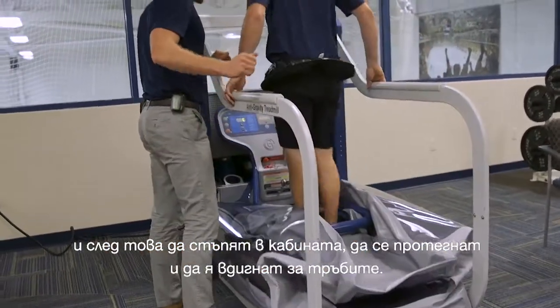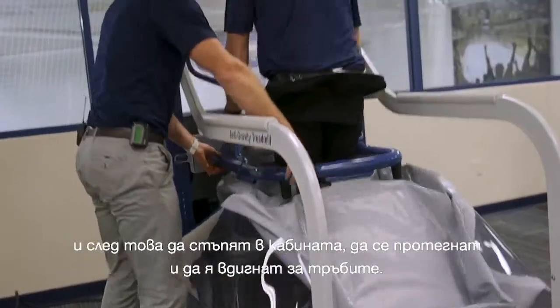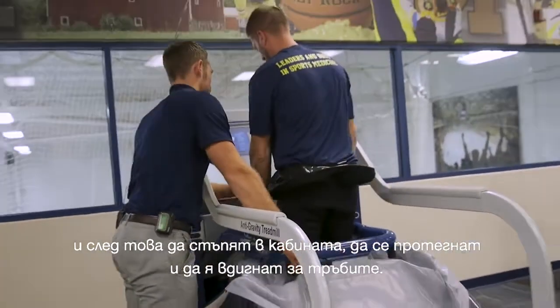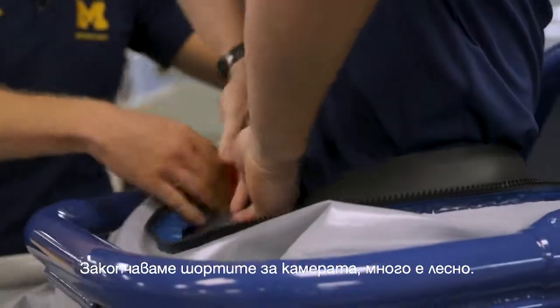Step into the cockpit and then reach down and pick it up through the blue pipes there. We zipper the shorts right into the cockpit, so it's pretty easy to do.